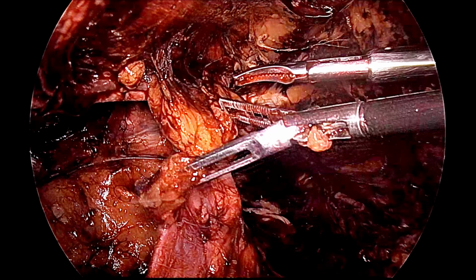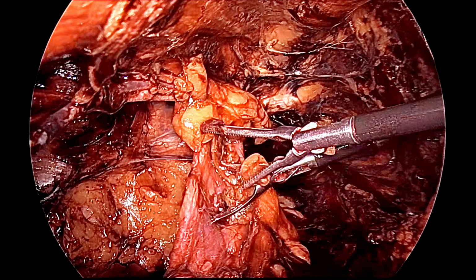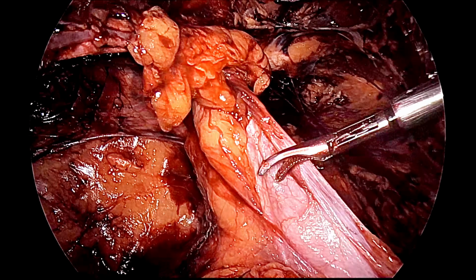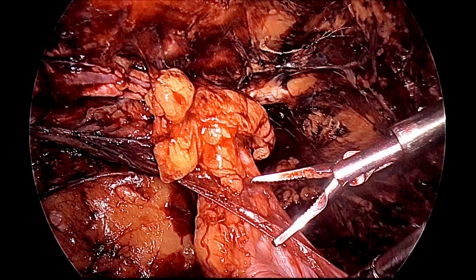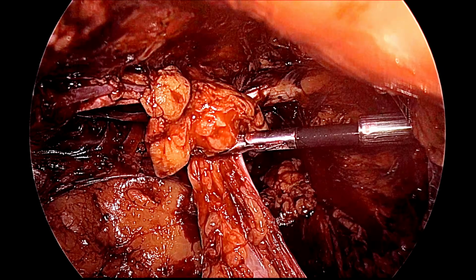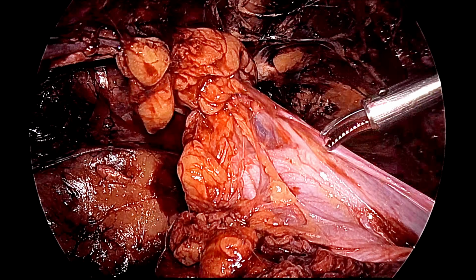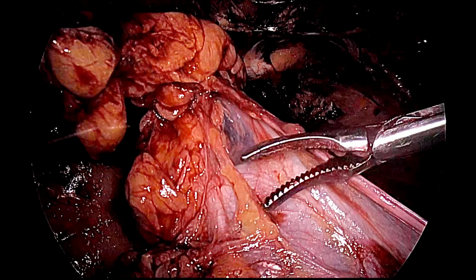Now, this is a small amount of fat which is on the anterior abdominal wall. It is not necessary to remove it, but if it is disturbing you, you can take it out. Now, we can see this is the spermatic vessel which was going laterally, and slowly you can keep on finding out the sac. So, this is the portion of the sac, and now you have to reduce it completely, because this is an indirect hernia. So, it is necessary that you separate it from the pseudo sac, that is the transversalis fascia, and here we can see it is coming now. Now, the margin is clearly visible, which will help you to separate.